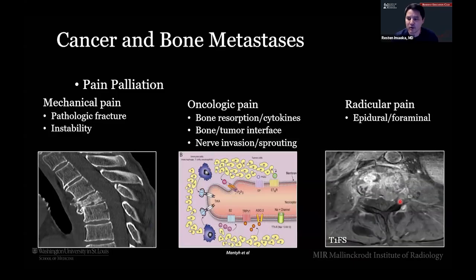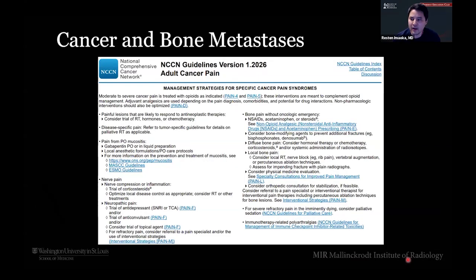And then, as I mentioned earlier, radicular pain. These patients often present to us this way. They may have initially had that dull, constant oncologic pain that was either controlled or maybe even tolerated with oral medications, but it eventually progressed to something like this, where here we've got a lesion. This is a fat-suppressed T1 post-contrast image, where you can see a significant epidural component here and then a foraminal component here, which is causing some stenosis. And this is where they end up getting radicular pain or myelopathic symptoms from all this epidural and soft tissue component. So why do they present to us so late in their disease? As I mentioned before, a lot of that is due to a knowledge gap.